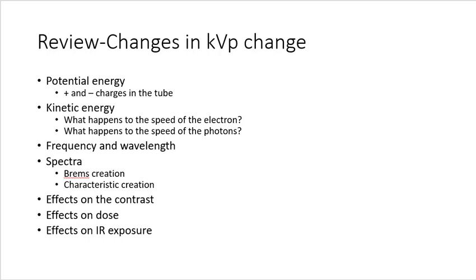Now, I've spoken quite a bit about kVp and beam quality. But if you remember back to last semester, we talked about how kVp is not the definitive measure of beam quality, and it's not. Because a high quality X-ray beam, if you remember, takes into consideration much more than just kVp.